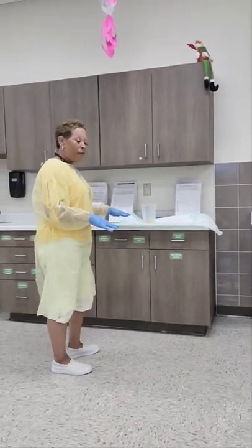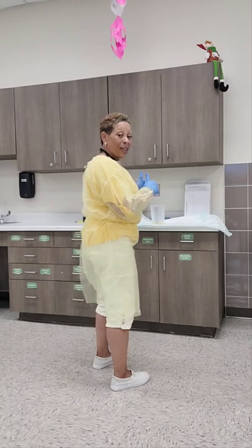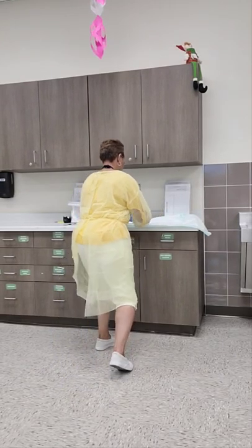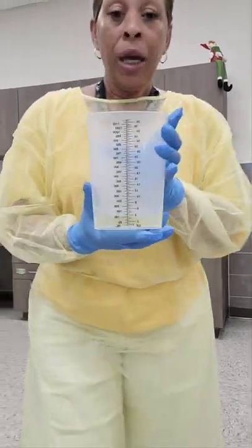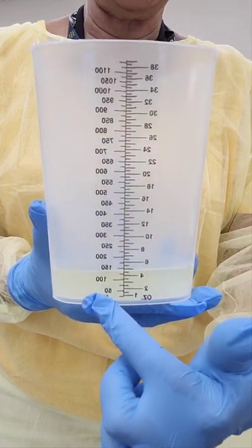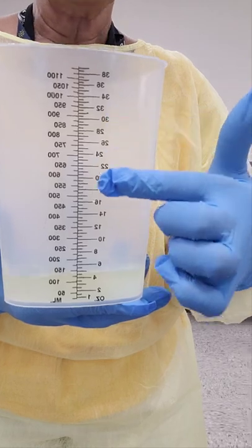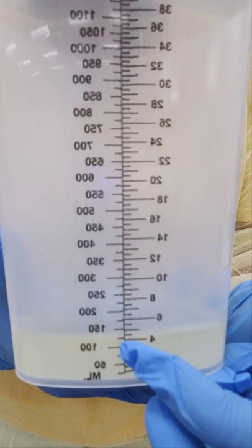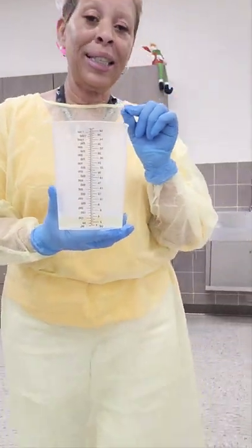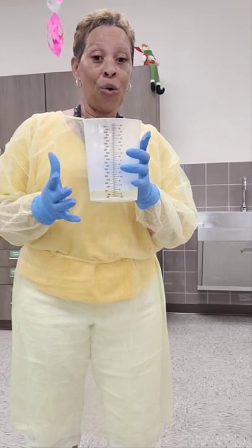Once I get it on the hard level surface, I'm going to wait a couple of seconds until the urine stops that wave-like motion, then squat to get to eye level and measure the urine. The graduate will have two sides of numbers: ounces, and on the left side, milliliters. You want to make sure that when you measure and record, you use the numbers on the left side — they'll be larger than the ounces. My measurement is between 100 and 125 cc's. If it's in between the tick marks, you will want to round up, so I am going to record 125 mls or cc's.